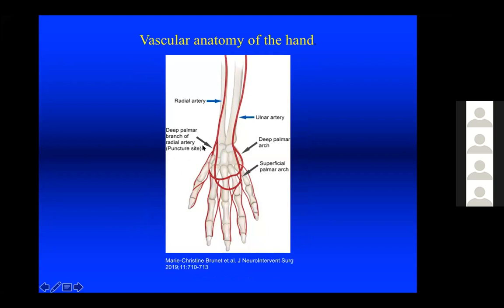This figure is important for 2 reasons. You can see this is where we usually access it, and this is going to be the anatomic snuffbox access site. So it's really close, about 2 centimeters. But this also shows you why many people report that radial artery occlusion is much lower using this access site, because there's other branches. If you thrombose your access site here, there's no real branches, and so basically occlusion of the radial artery propagates back to the bifurcation from the brachial.